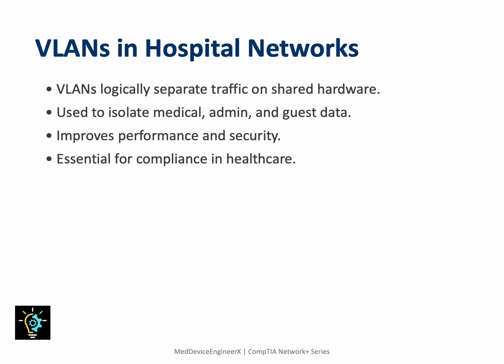Hospitals use VLANs to keep networks organized and secure. A ventilator might operate on a dedicated medical VLAN, while office computers run on another. The StealthStation Flex ENT, for example, can transfer DICOM data on its own VLAN to prevent interference with other systems. Understanding VLAN tagging and configuration helps biomedical engineers ensure safe and compliant device networking.